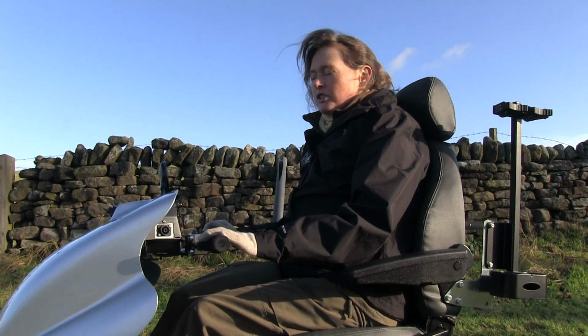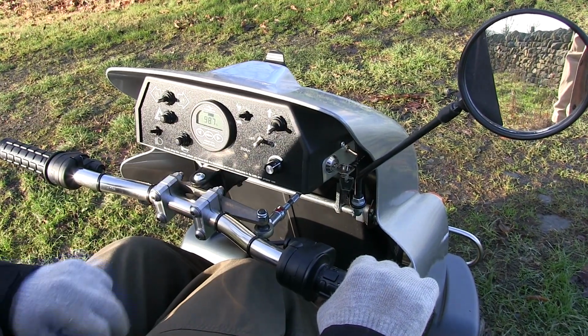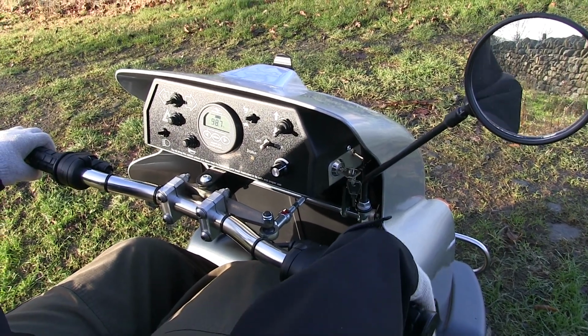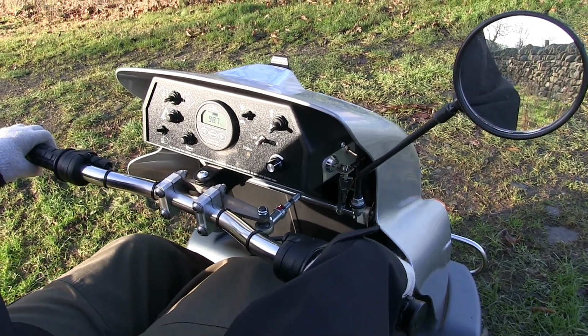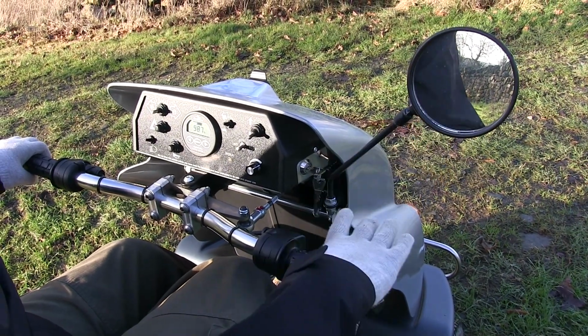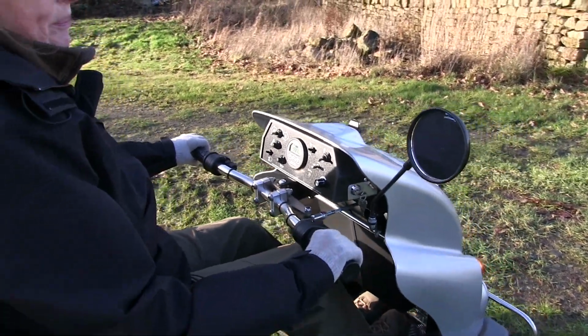In the event that you do need to reverse, remember to adjust the control to reverse, and then you've got your mirror if you want to look behind you and you can't look over your shoulder, and then just simply twist the grip and you'll start to move backwards, and release to stop.